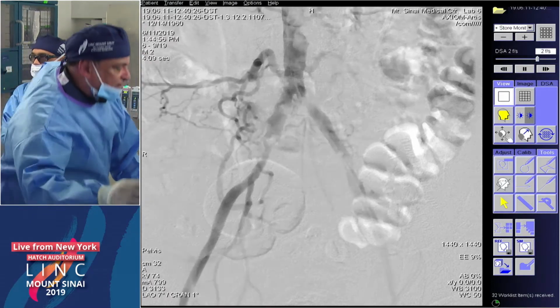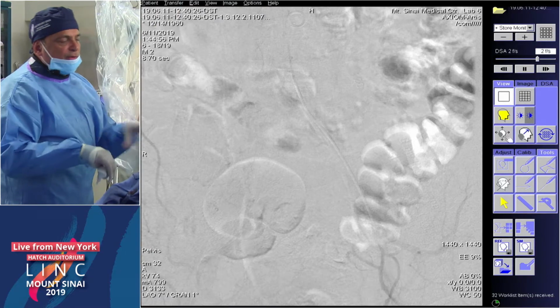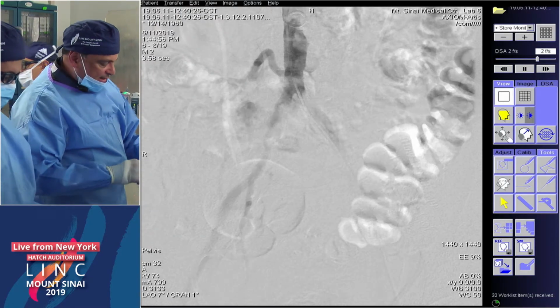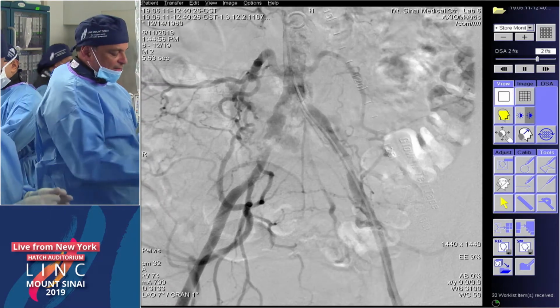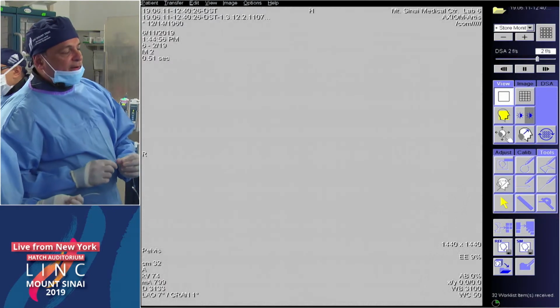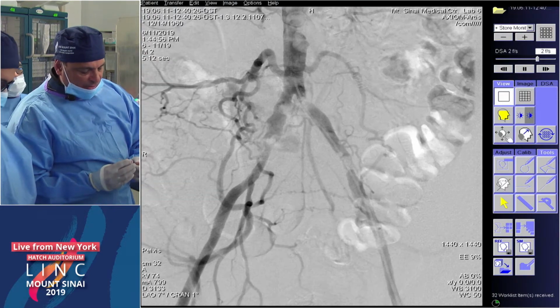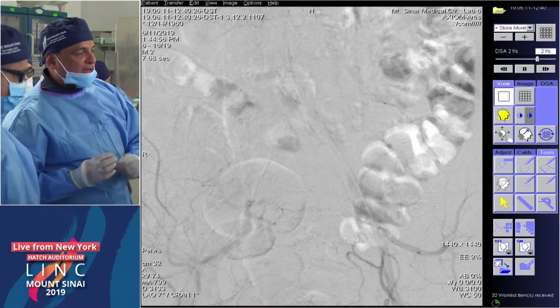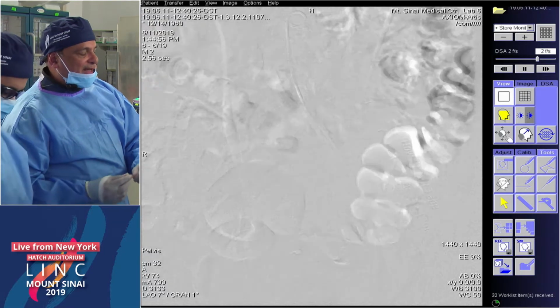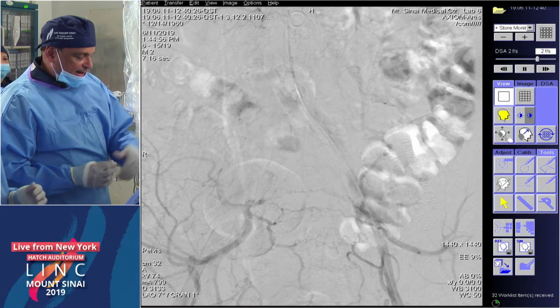So, I mean, we talked about that, myself and Dr. Kapoor, and I don't know what Dirk or Jim, Carlo, whoever's on the panel today would say, but what we were thinking is, in this situation, why not do a Shockwave device into the iliacs? We have, as you know, Jim, especially in the TAVR program here at Sinai, been using a lot of Shockwave to prep the vessel in these kind of very, very calcified iliacs. And it works very well in this particular area.